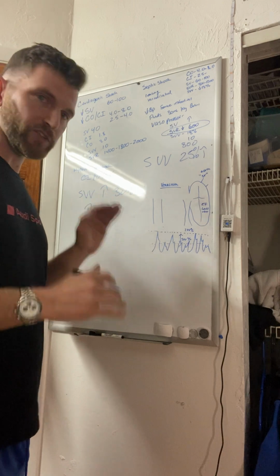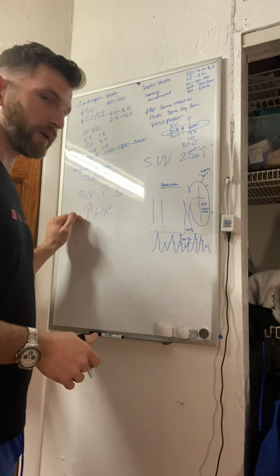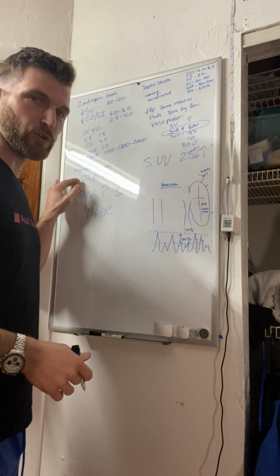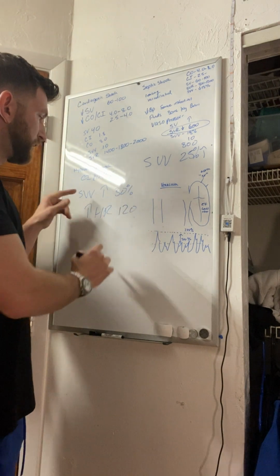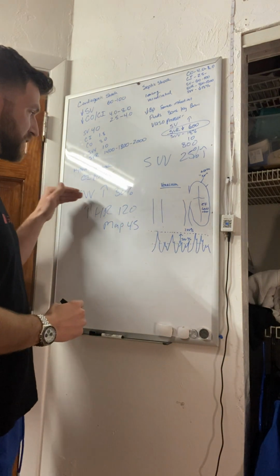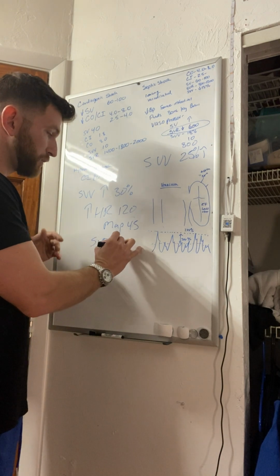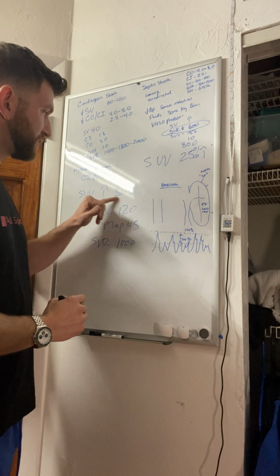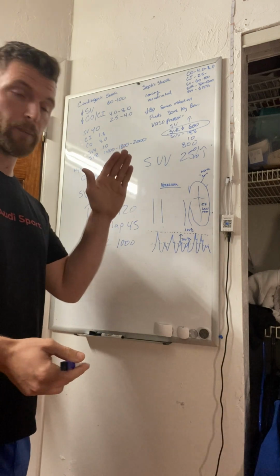But a normal physiological response to low blood volume is increased heart rate to try to compensate. You may see some alteration to the cardiac index, output, and stroke volume, but they may be fine. It may be compensating really well. You may have a heart rate of 120. You may have a MAP of 45, and this patient has an SVV of 30, right? And the SVR may be normal, maybe 1,000, okay? But the big thing you're seeing is the SVV.